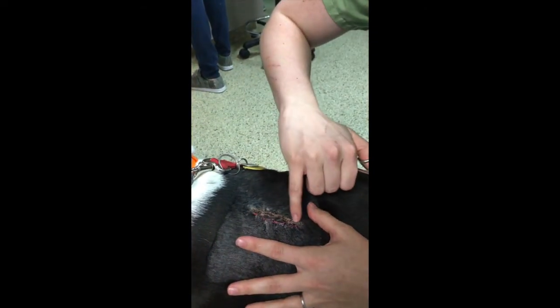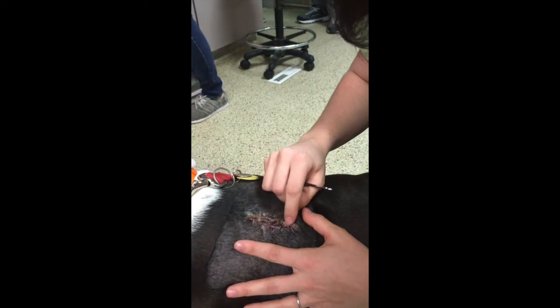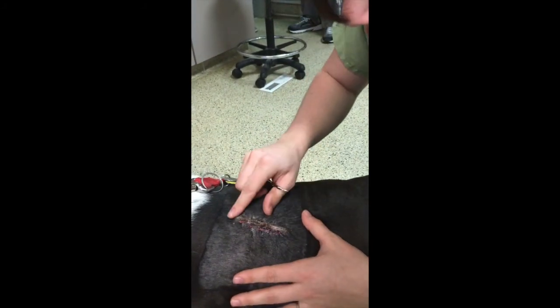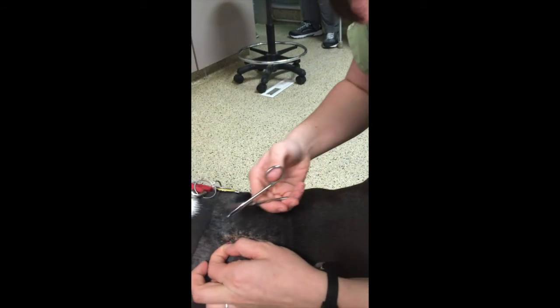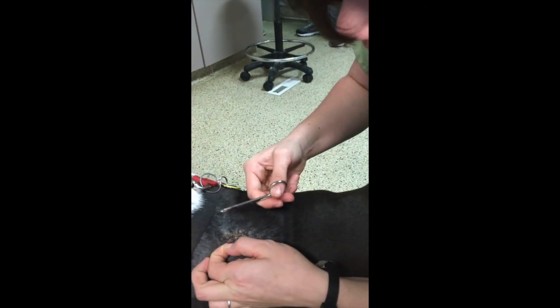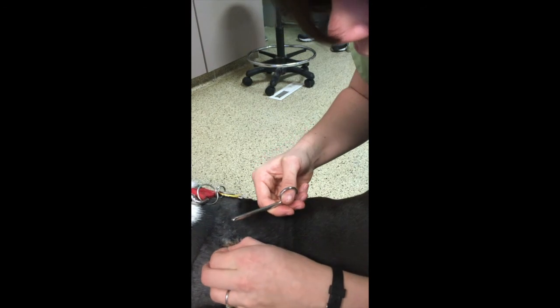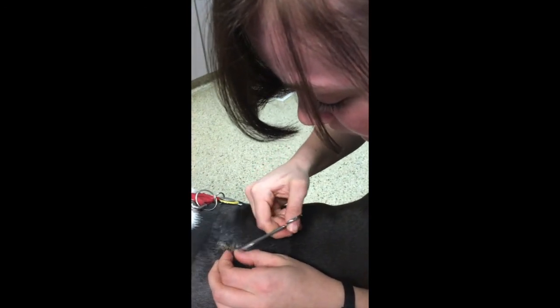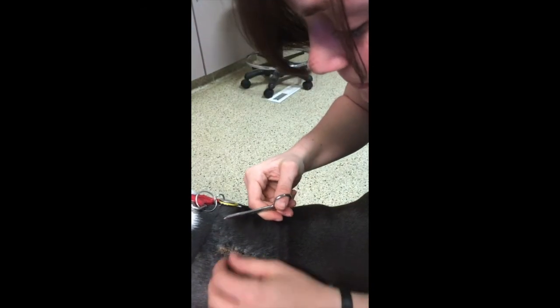You can see that there's some crusties. Once you pick them off, you can see the skin is healed. It's not red or irritated or swollen or looks like it's infected. I'm going to go ahead and pull out the suture. You just want to clip one side of the suture and then pull it out. There we go.